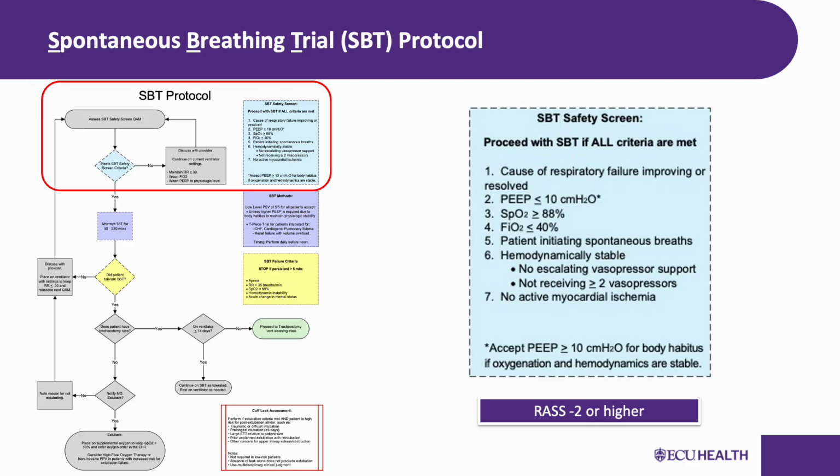This ensures proper physician oversight on patients who are being managed outside of protocol parameters. The key workflow change here to internalize is every morning we screen, review the RASS that nursing has documented, and communicate with them about sedation readiness. If on protocol and the RASS is at -2 or better, coordinate and communicate with nursing, and you as the respiratory therapist proceed with SBT.